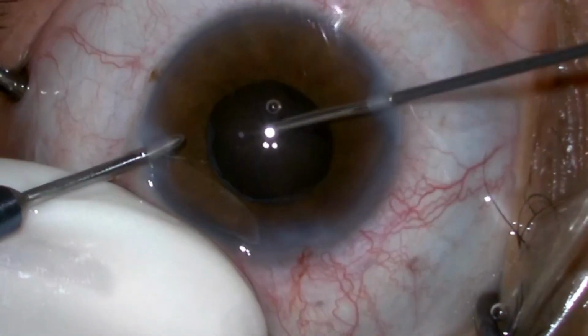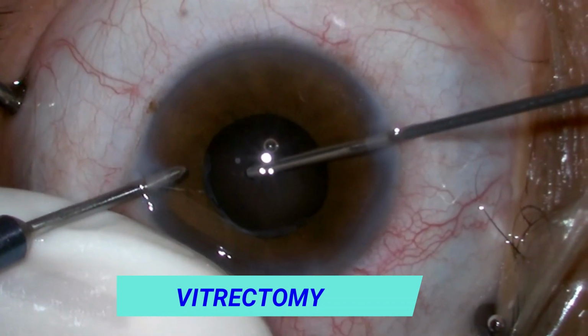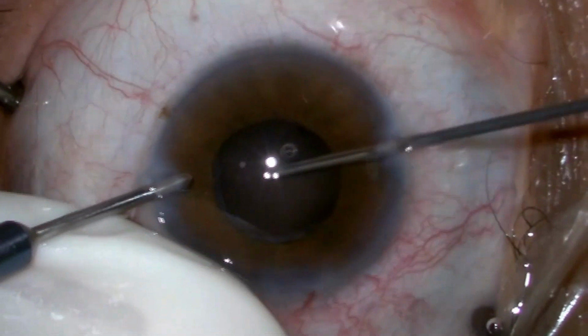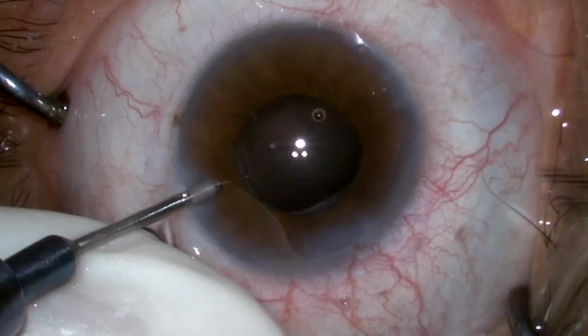Once the lens is out, as there was a YAG capsulotomy, there was a little bit of vitreous coming out. So we did a vitrectomy to make sure that there was no vitreous strand in the anterior chamber.